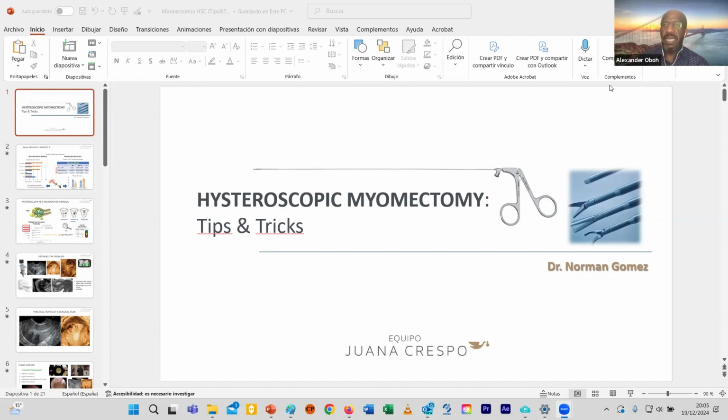I think my summary of tips and tricks of hysteroscopic myomectomy is simple. I use the word SAPP. You have to look at the surgeon's skills, which your last but one slide talked about. How skillful are you doing the hysteroscopic work? Have you got the skill and the training? That's important. And what's the availability of the equipment you need?